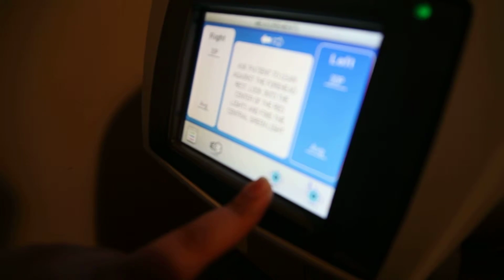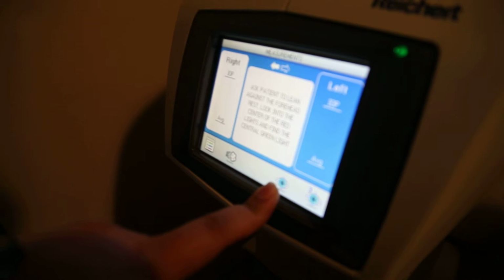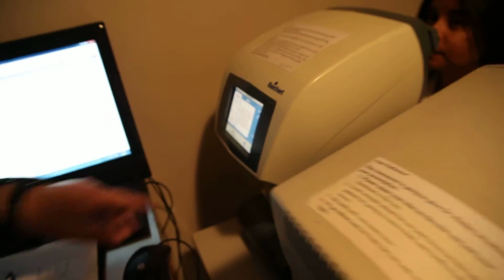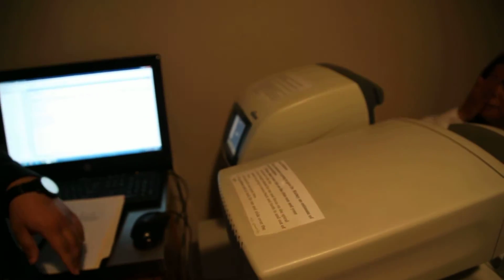So you'll let them know, in just a moment, ma'am, you're going to get a small puff of air in your right eye. And then you can go and sit back, Linda. I'm not really going to blow it in your eye.